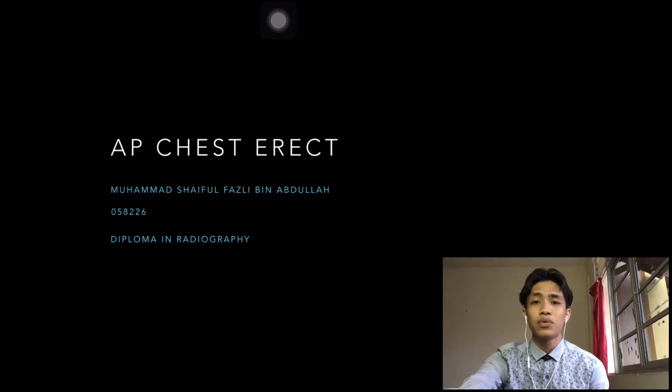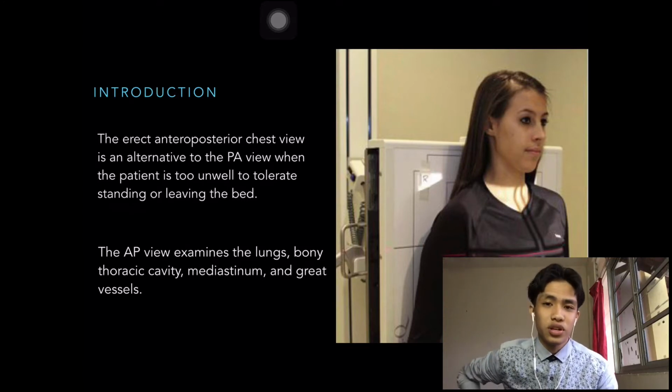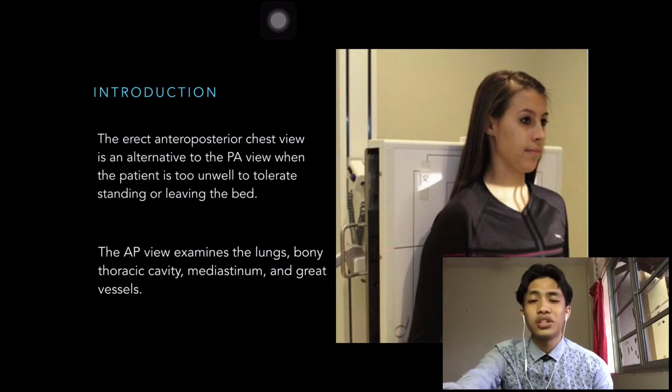So today I'm going to present about AP Chest Erect. AP Chest Erect means anterior posterior chest projection. So we project from anterior to the posterior, and that we call AP chest projection.